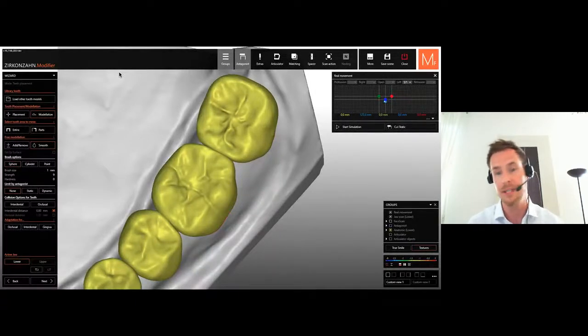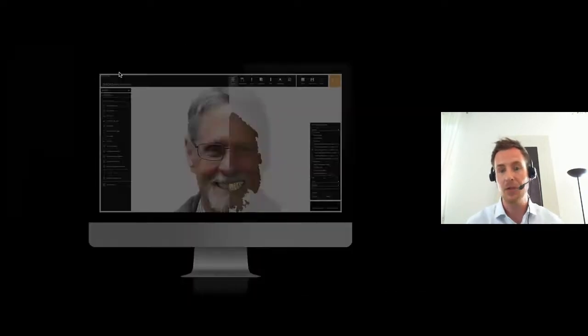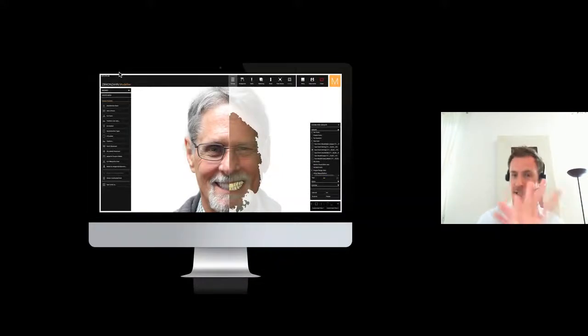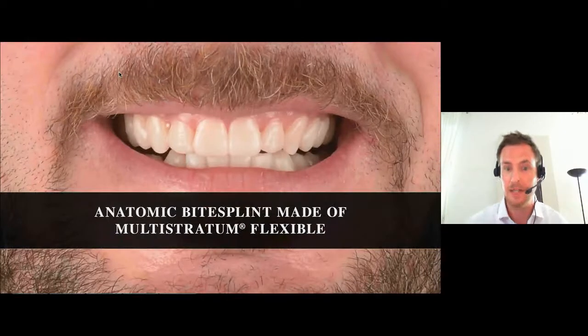And this is amazing. So when I have all this information, or less, it's not a must to work with all those instruments, but it's the optimum. That's the high standard, I would say. Then we can continue with our designing.